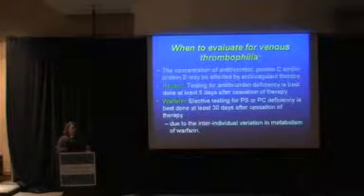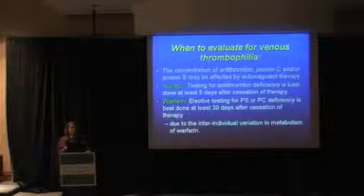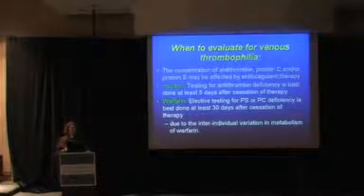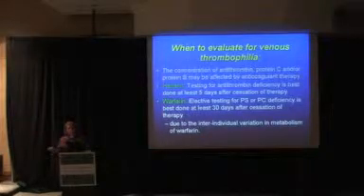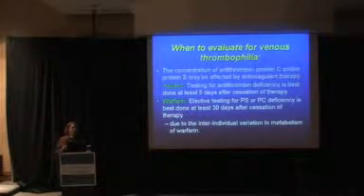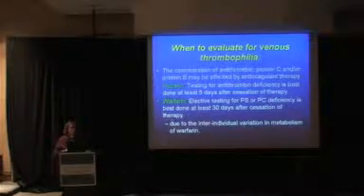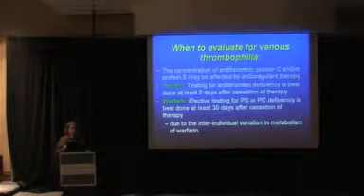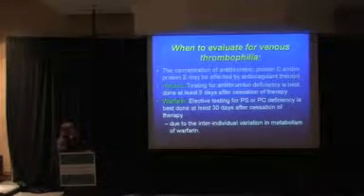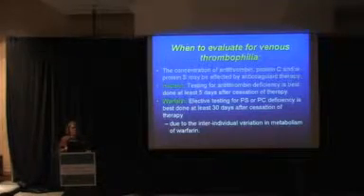Now, there have been several papers published on how to look for protein C or protein S deficiency in a patient who's on Coumadin. Can you do it by doing a ratio of protein C activity to, say, factor 2 or factor 7? Yeah, you probably can, and I know there are some reference laboratories that do this, but the data isn't really good that there isn't some sort of crossover with this, and I really think it's best to do the testing to try to exclude these when the patient's off of warfarin therapy.